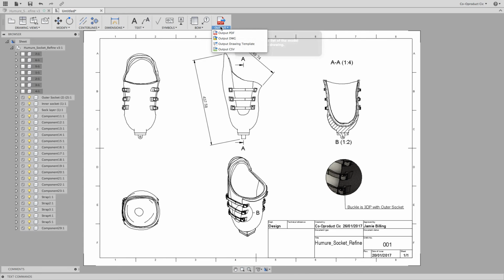And finally, we can output our documentation. We have a number of format choices to output. We can output PDF, DWG, drawing templates, or comma-separated value documents.